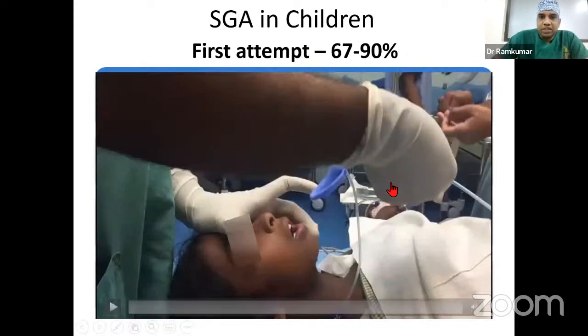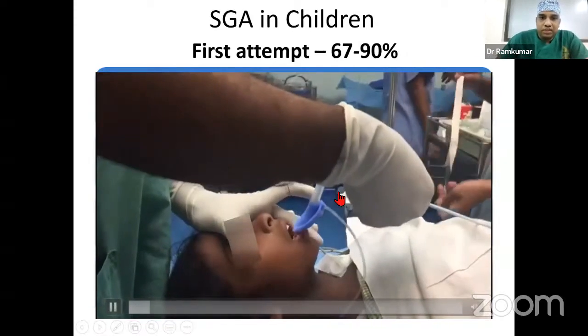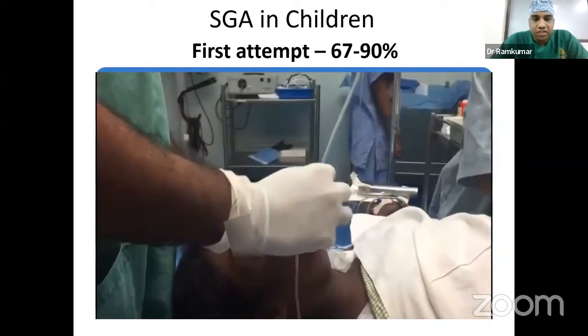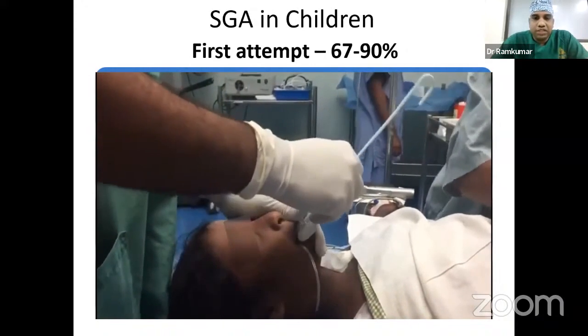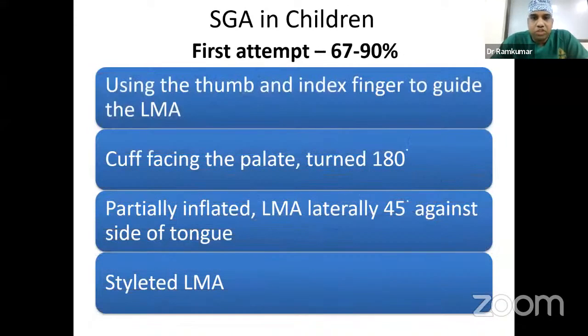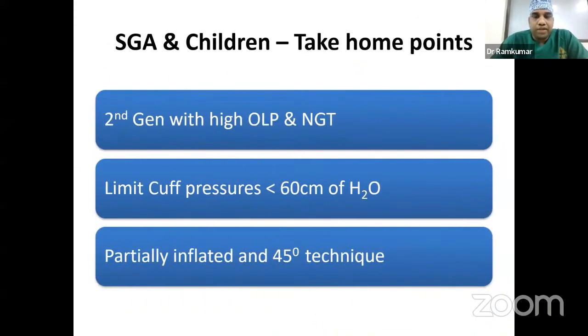Here I pass the stylet into the airway lumen. It assumes an ILMA curvature or a naso-oropharyngeal curvature. It's almost 90 degrees. It's easy to insert, doesn't require your distal fingers to insert it, and you remove the stylet once it's done.